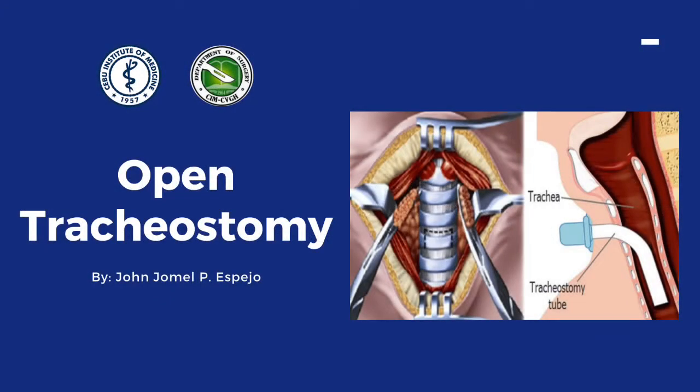Good day, I'm John P. Espejo, a clinical clerk from Cebu Institute of Medicine. In this video, I'll be demonstrating the procedure of open tracheostomy using improvised materials.